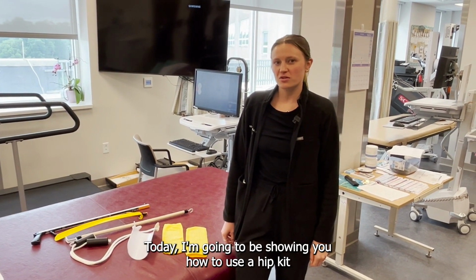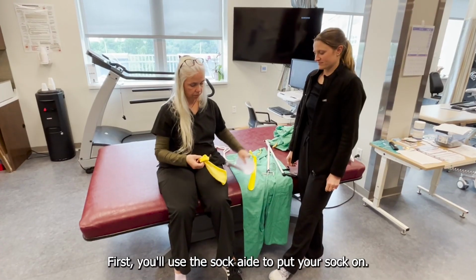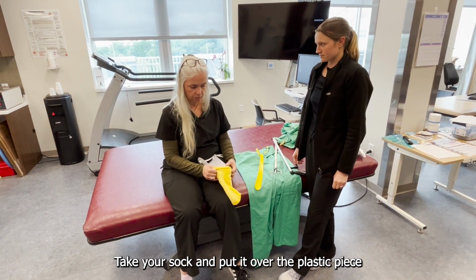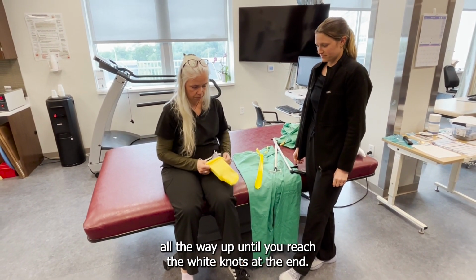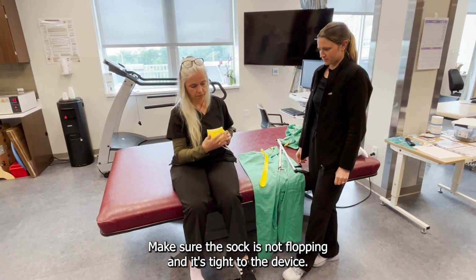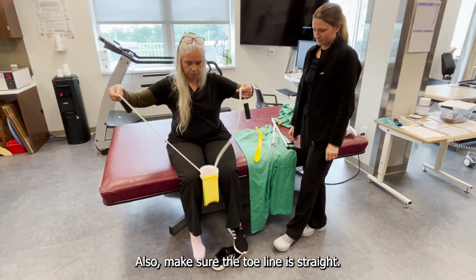Today I'm going to be showing you how to use a hip kit after a joint replacement or a spine surgery. So first you'll use the sock aid to put your sock on. Take your sock and put it over the plastic piece all the way up until you reach the white knots at the end. Make sure the sock is not flopping and it's tight to the device. Also make sure the toe line is straight.